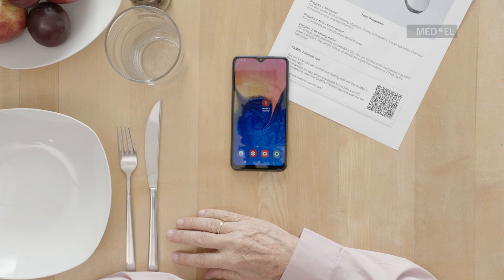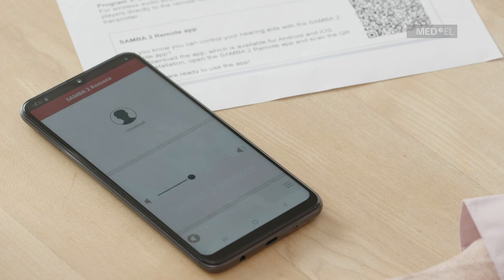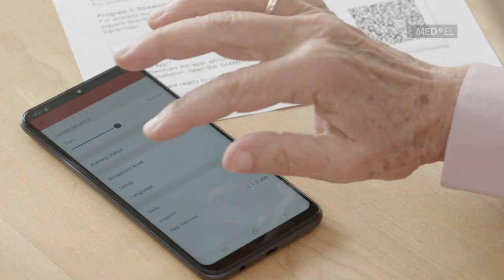To set up the Samba2 Remote app, first download the app from your App Store. Click on the menu button at the bottom of the main screen. Select Setup from the list.